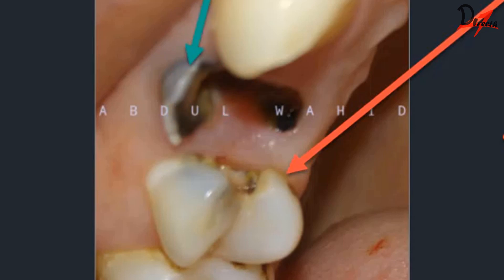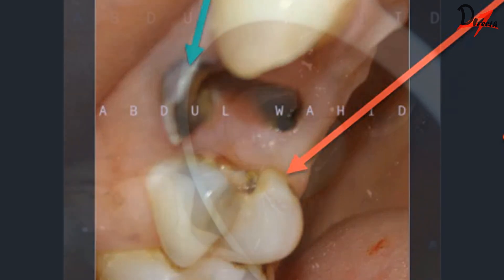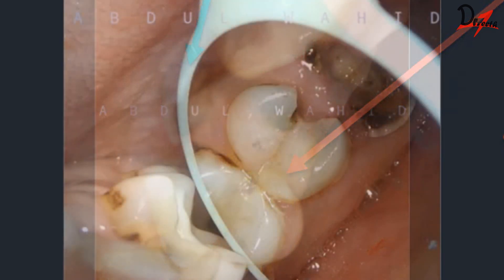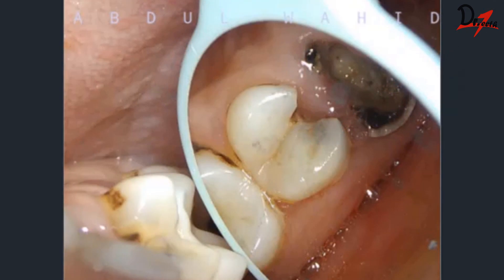These ragged and sharp edges will pose a difficulty in proper isolation of the case, and we will see how we address that. This is the occlusal surface, and this is how the occlusal view looks.